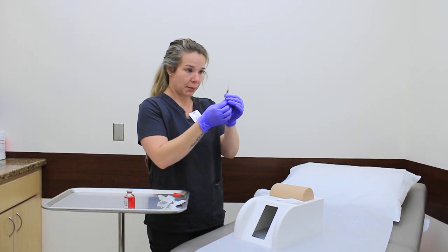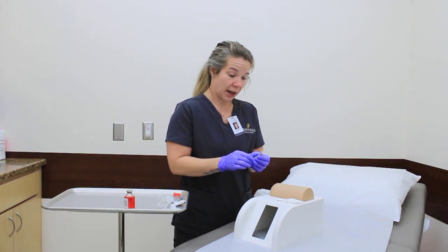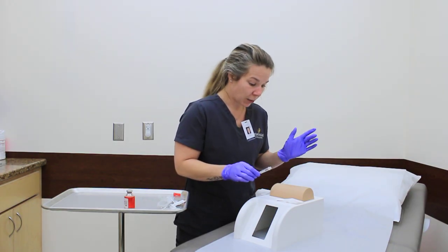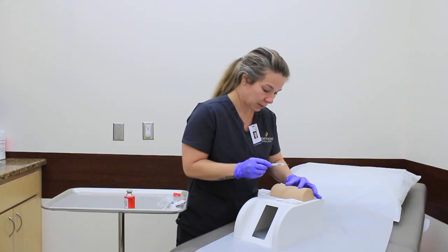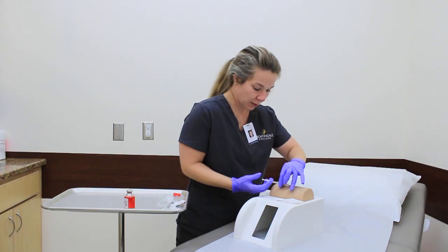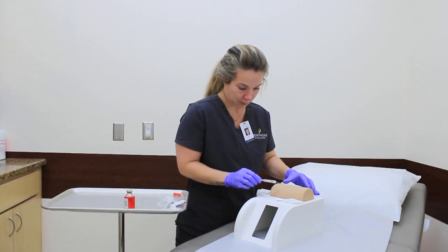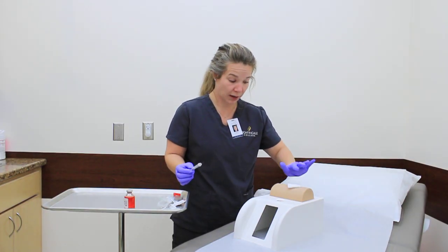Make sure that the bevel is up. And insert the needle at a 5 to 15 degree angle, and then only going into the skin roughly 3 millimeters. I'm going to use my non-dominant hand to hold the skin taut. And then I'm going to take my other hand, stabilize the needle, and then inject. Perfect. Place a little bit of gauze over that, not applying any type of pressure.